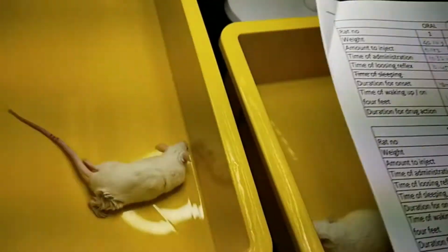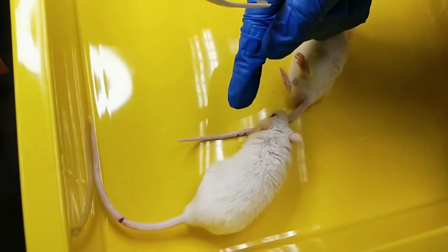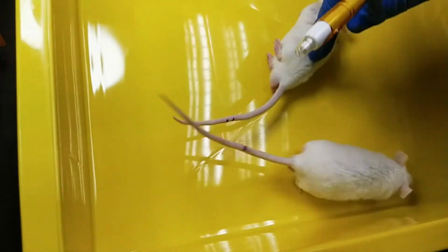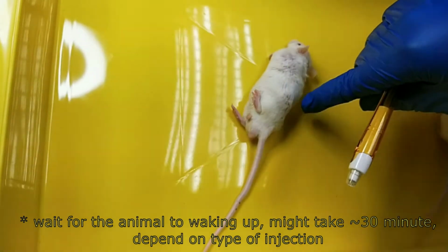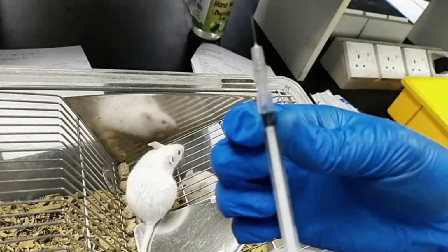Okay, so after a few minutes, we're going to record the time for the animals to wake up. So as you can see from here, this is the mice number 1. He's already waking up, they're able to walk again. For the mice number 2, they're still in the unconscious state, as you can see here. So now we're going to proceed with the injection number 4.